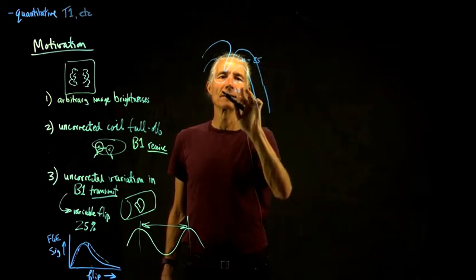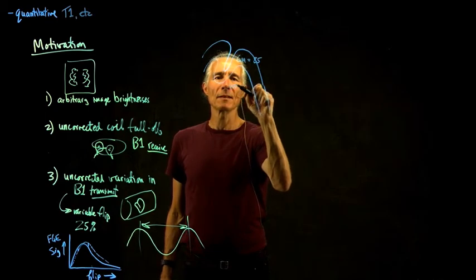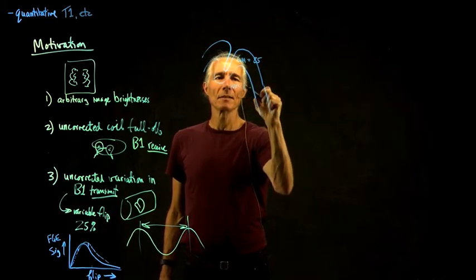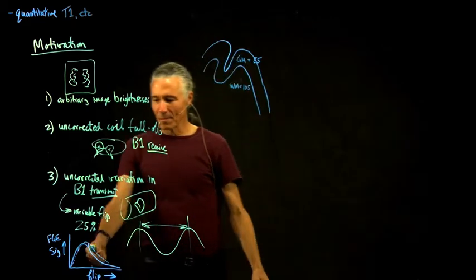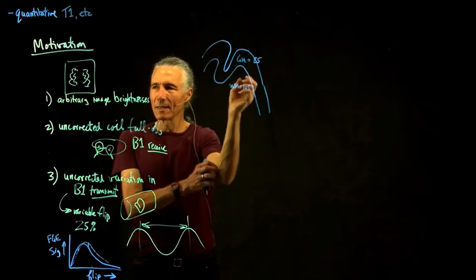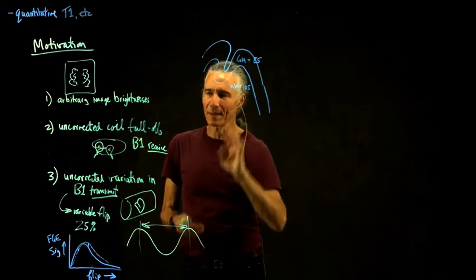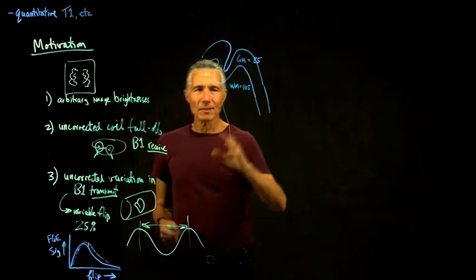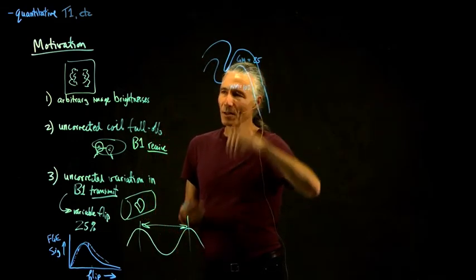If you have something with really nice contrast, sometimes it's less than that, but we'll say 105 and 85. So if we're messing around with the flip angle, we could easily overcome that. But that's still, we have enough contrast between gray and white matter where you can usually tell them apart.